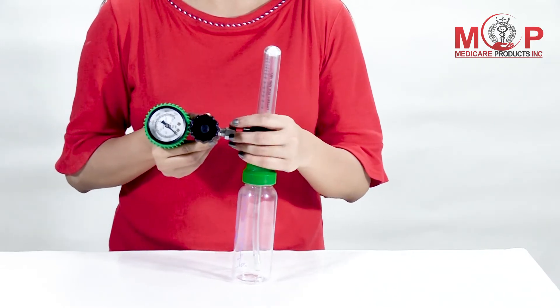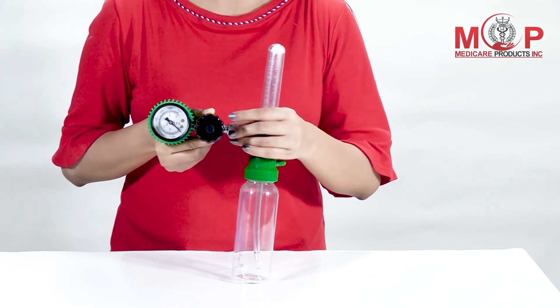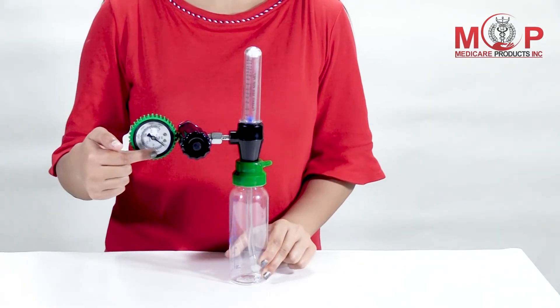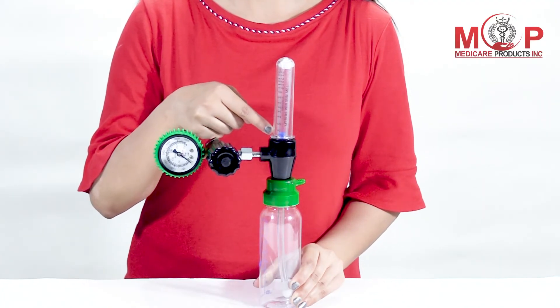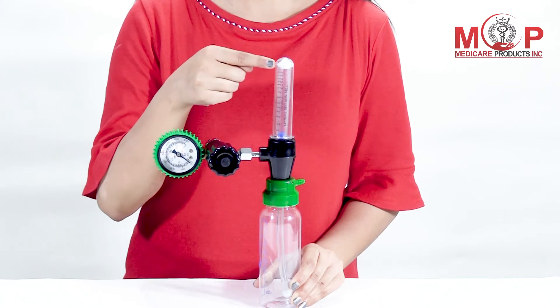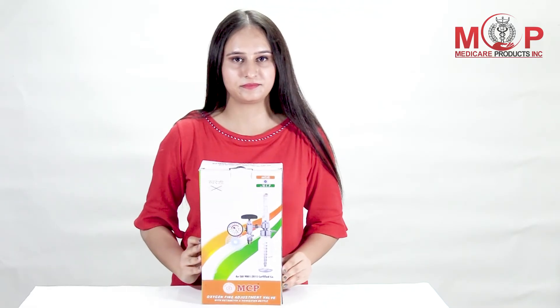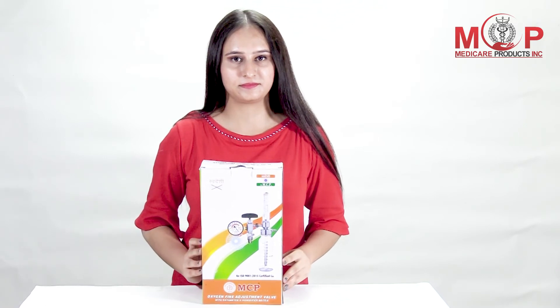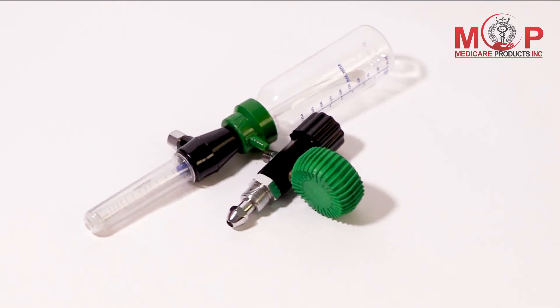The humidifier bottle is made of durable, impact-resistant polycarbonate material. All body parts are chrome-plated and made of brass for high durability and long life. The glass flow tube is clear and simple to read. It is widely used in homes, hospitals, medical clinics, and more.